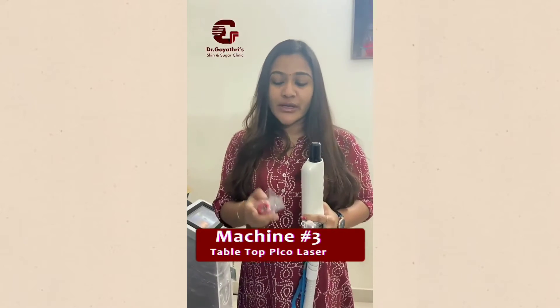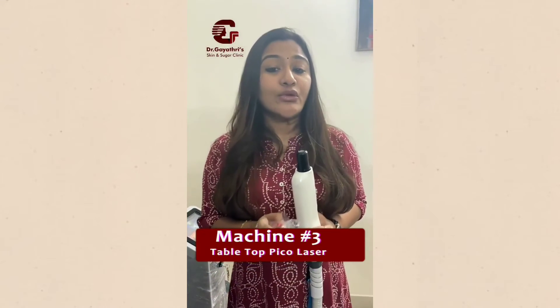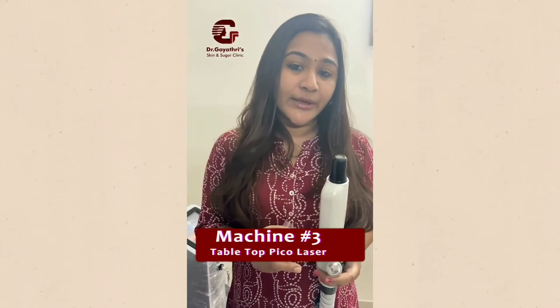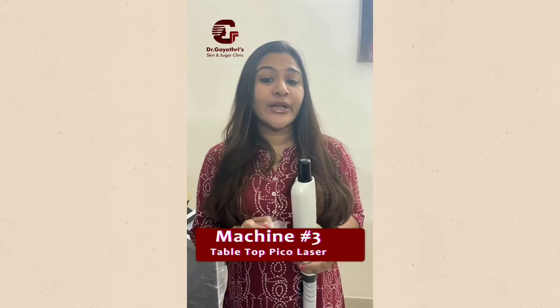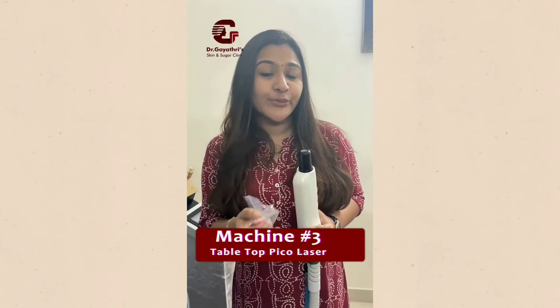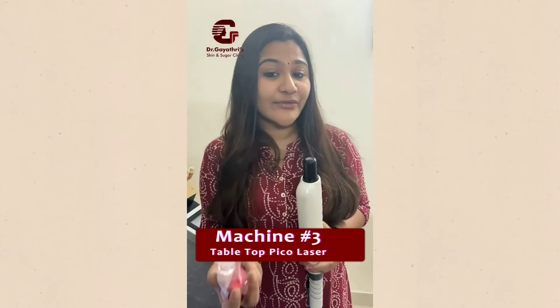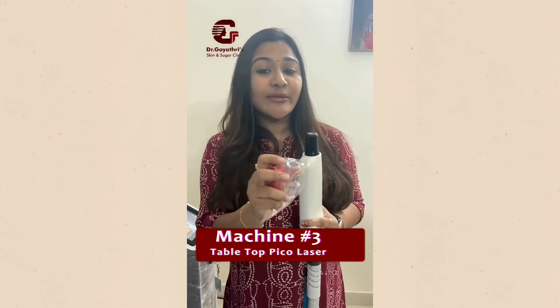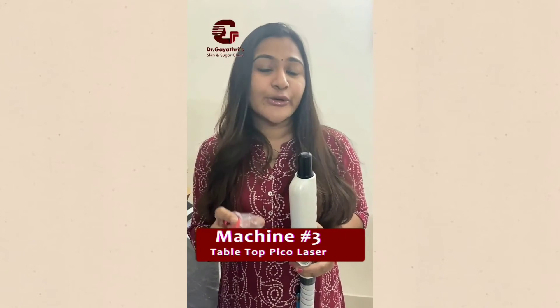This laser can also be used for tattoo removal depending upon the kind of tattoo. Over a black tattoo, yellow tattoo, green tattoo, red mercury-based tattoo — depending on the particular color-based tattoo, we can accordingly switch the filter and remove it.